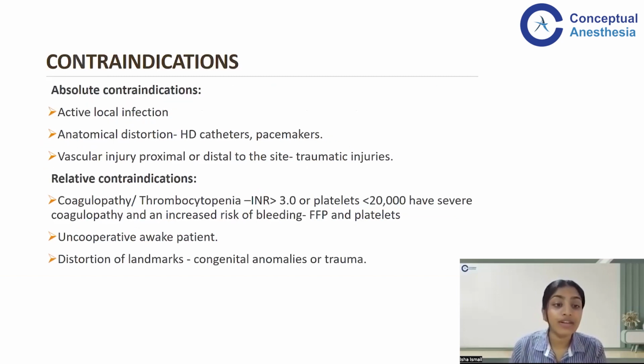Now, when we come to the contraindications, the absolute contraindications would be a local infection, because this will seed the infection into the bloodstream itself. Anatomical distortions because of the presence of a catheter already or a pacemaker already, and vascular injury because, again, in a trauma patient, if there is injury to the proximal or the distal area, there's a break in the vasculature itself, so you cannot administer any drugs.